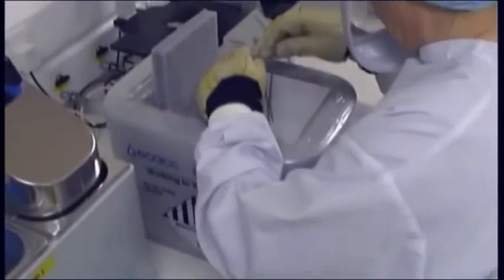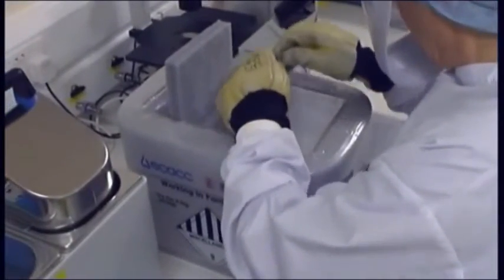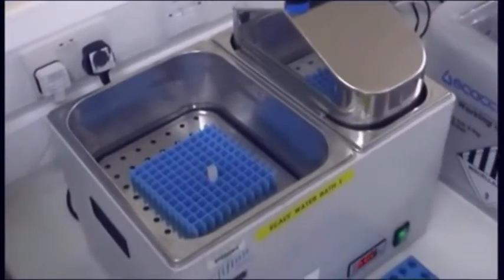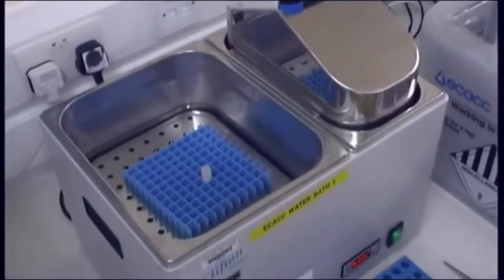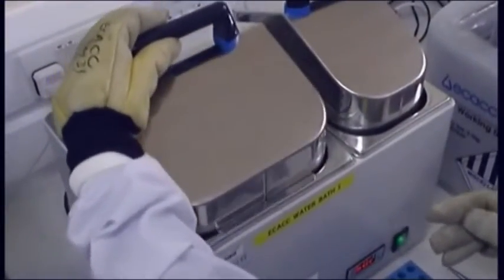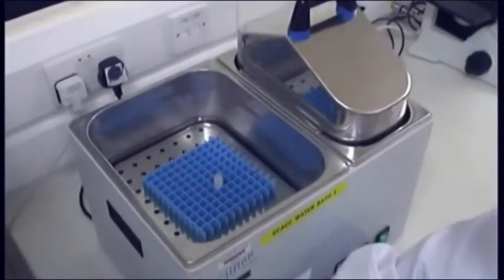Remove the ampoule from the container and place it in a water bath set at 37 degrees centigrade. Do not use the incubator to thaw out the cells as this method is too slow and will adversely affect the viability. Avoid getting water near the cap, which is a potential contamination route, by only covering the lower half of the vial.